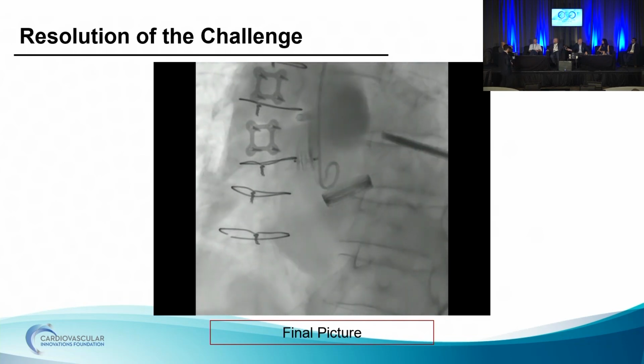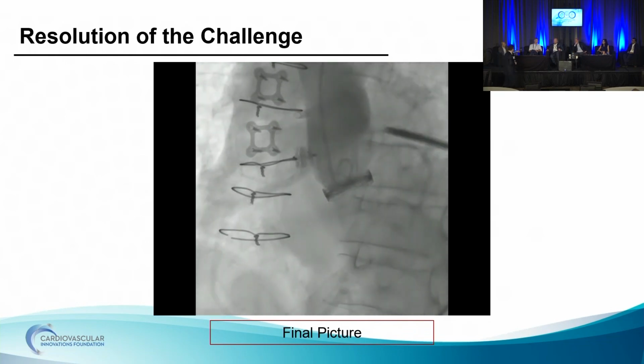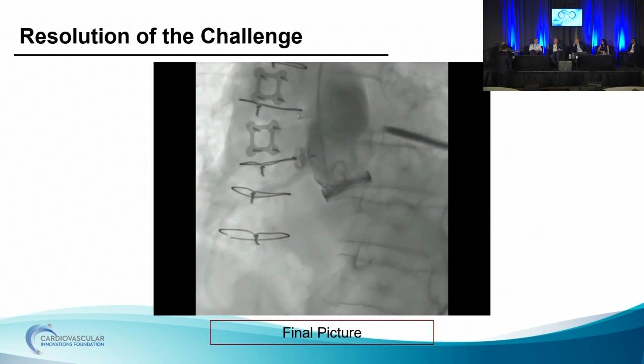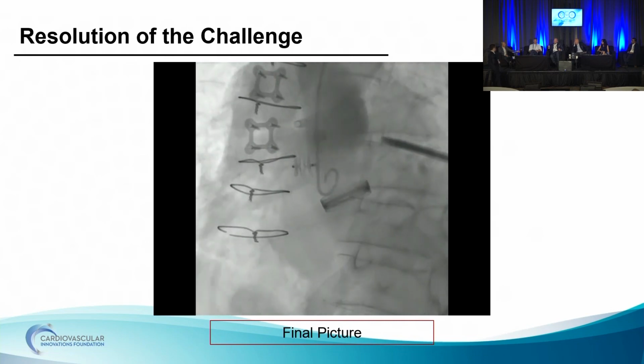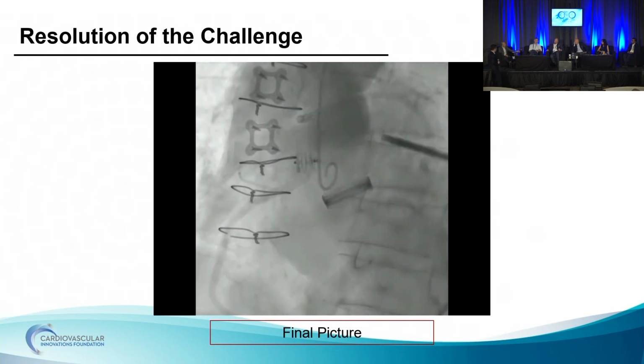I don't know. I have no idea. I actually, for these, often will choose an ASO. It's got a membrane in the middle. It's thin, and usually though it looks like a neck, it's just a tissue plane, right? So having a short thing, I think, works okay.